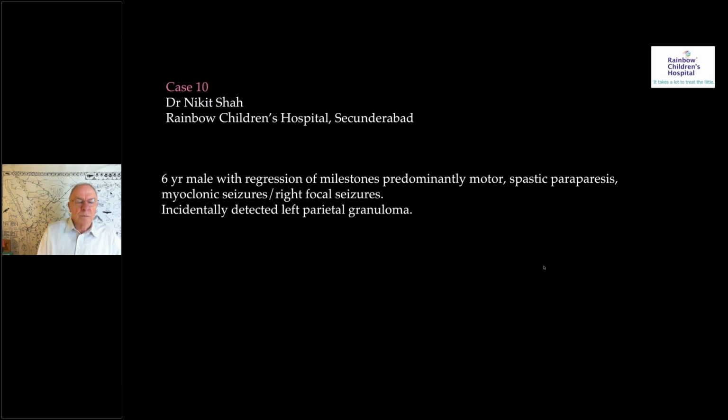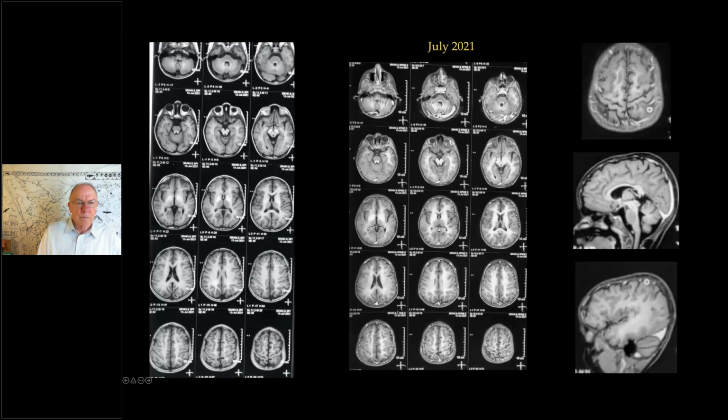Okay, sure, thank you. So these are the initial scans done in July 2021. These are external scans. On the left is the T1 non-contrast sequence. I think the quality is not optimal, but here you can appreciate T1 hyperintensities along the bilateral basal ganglia, more around the globi pallidi. Also, on the top, the midbrain is abnormal, demonstrating these hyperintense changes. The dorsal pons also demonstrates changes. The ventral pons, or the pontine belly, is normal in signal. The cerebellar white matter and the dentate nuclei also demonstrate T1 hyperintensities.